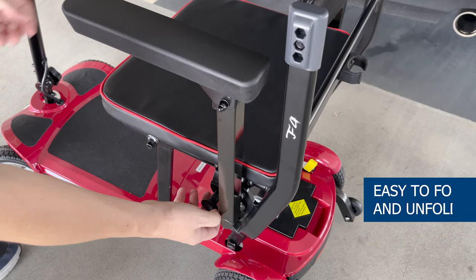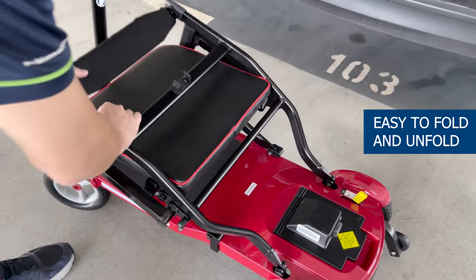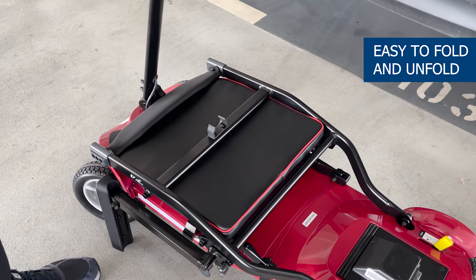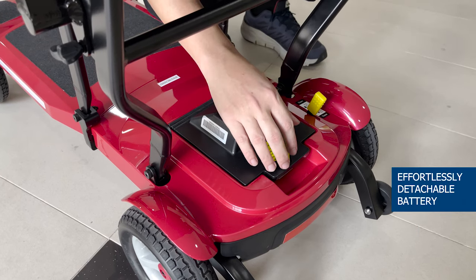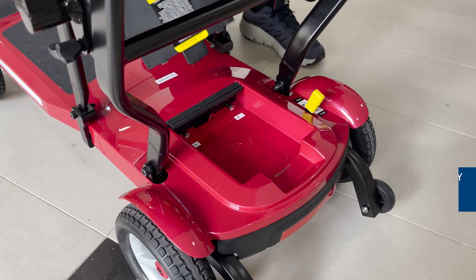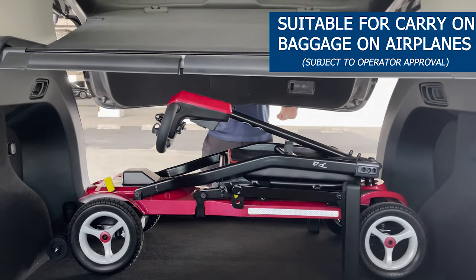With its quick folding mechanism, it can be folded and unfolded within seconds, allowing you to seamlessly transition between travel and storage. The battery can also be effortlessly detached, making it suitable for carry-on baggage on airplanes.